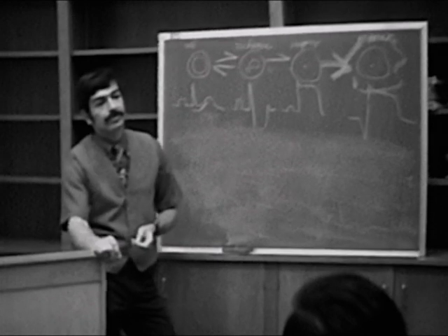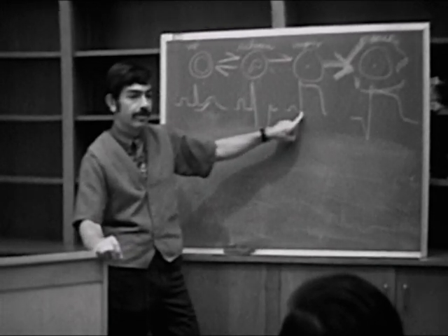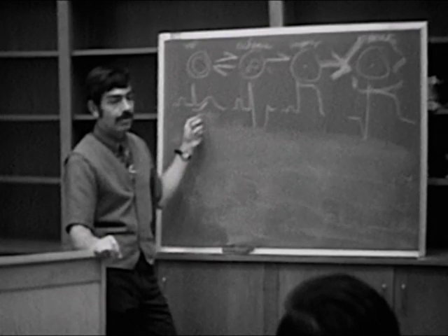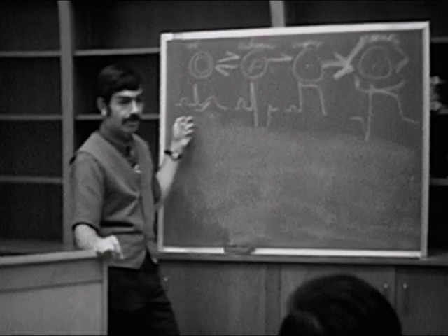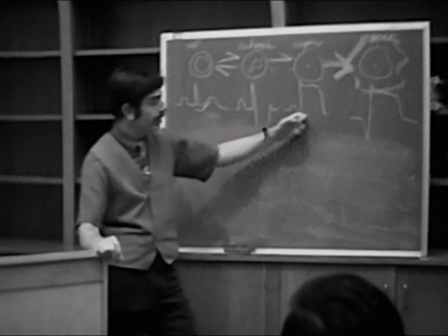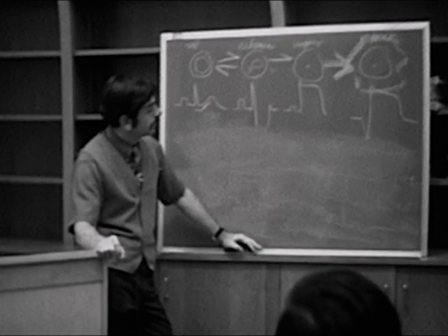How do you know when you get that? Well, you record the EKG during an attack. He looks like he's about to infarct, has changes like this, and then you give nitroglycerin or tincture of time, and the attack goes away and he returns to normal. And sometimes you can gradually see this receding to normal, and then you can see it getting worse again. See it going back and forth, and this recurs time and time again. If somebody were going on to infarct, you'd see this appear, and they'd go on to infarct. It's very unlikely that he'd keep going back. Though it's possible, I suppose.